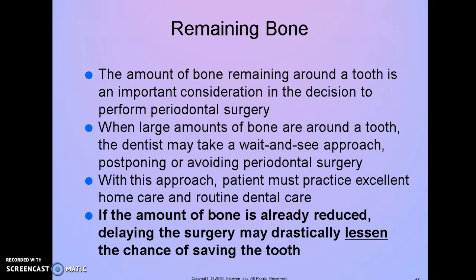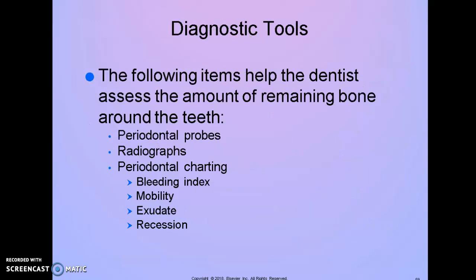If the amount of bone is already reduced, though, delaying the surgery may drastically lessen the chance of saving the patient's teeth. We are going to use the following items to help the dentist assess the amount of remaining bone around the teeth.